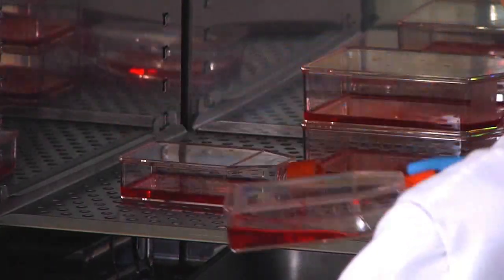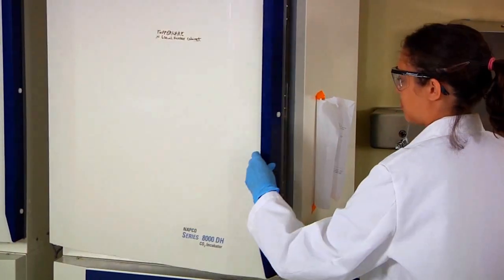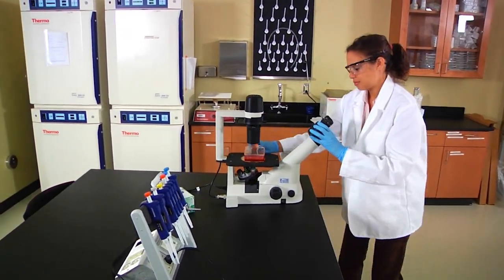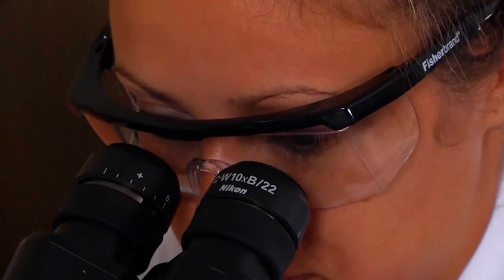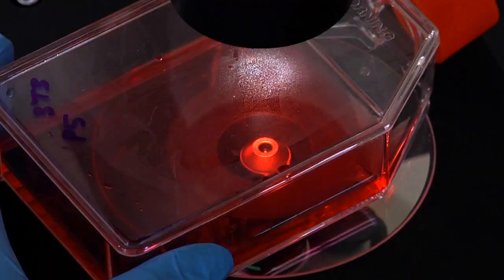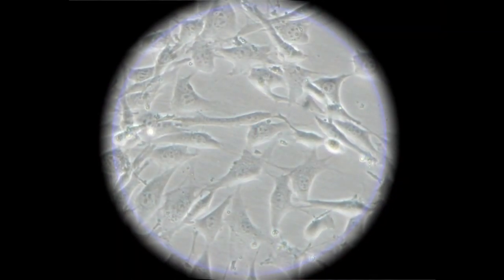Visually inspect the cells for a change in pH, which can be detected by a discoloration of the indicator phenol red. Examine the cell culture under an inverted microscope. Look for any signs of contamination or unhealthy cells. These cells look healthy.